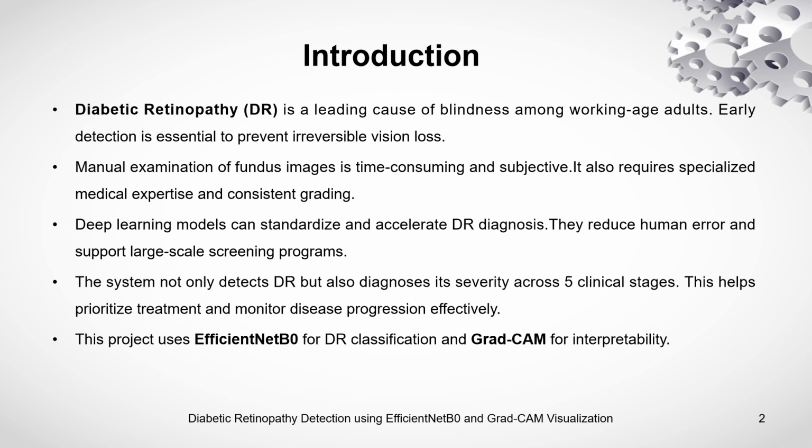screening. The proposed system not only detects DR but also diagnoses its severity across 5 clinical stages. This helps in prioritizing the treatment and monitoring disease progression effectively. So the proposed model is EfficientNetB0 for DR classification and Grad-CAM for interpretability.